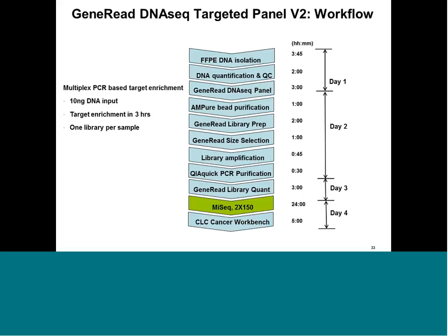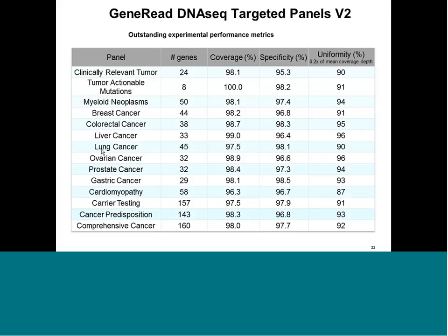And this, I've shown you the workflow from FFPE slides, extracting DNA, generating small libraries, adding molecular identifiers and sequencing primers, and then go on a next generation sequencing platform and sequence with high coverage and high sensitivity. And such panels are now available for many tumor applications, so you don't have to dig in these public libraries and search for informative genes. There are commercially available gene sets adapted to breast cancer, to colorectal cancer, to lung cancer, and so forth.